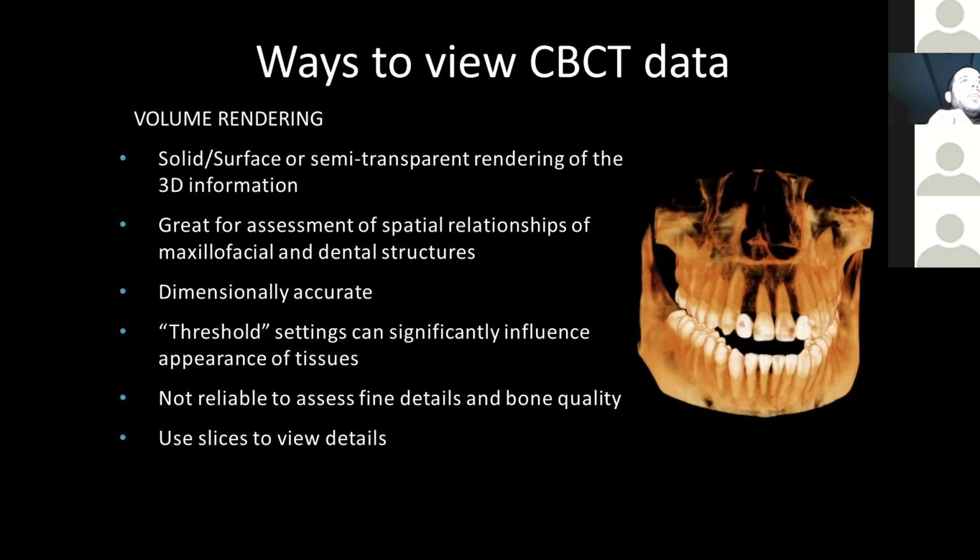Is there any use in measuring airway space in sleep apnea if the image is taken either in prone or supine position? Thanks for asking this question. On a cone beam CT, with software that will do an airway measurement, you can actually get a nice airway volume or cross-sectional areas. In other words, the machine does a great job of providing that information. In terms of whether there is value in taking it in either the prone or supine position, it gets a little trickier.